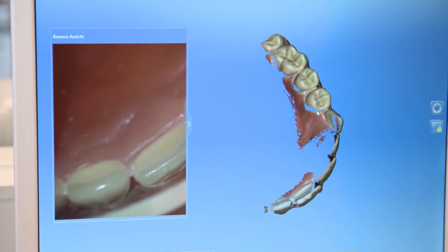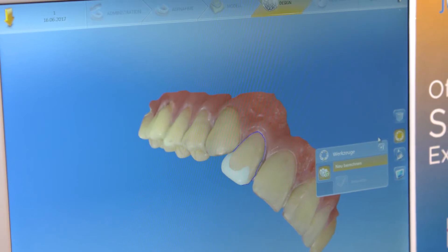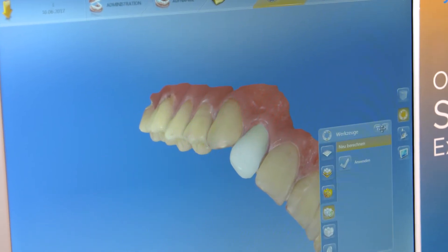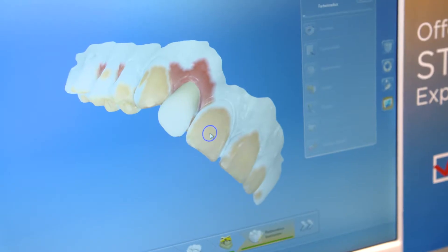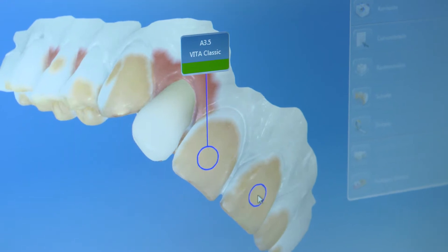Tooth color analysis is now available on 4.5 and it's working really good. We tried comparing to digital color meters and even with scales and it's working very fine. I am using this feature and to me it is very, very nice. You can automatically know what color you need in your restorations and it's very nice to work with.